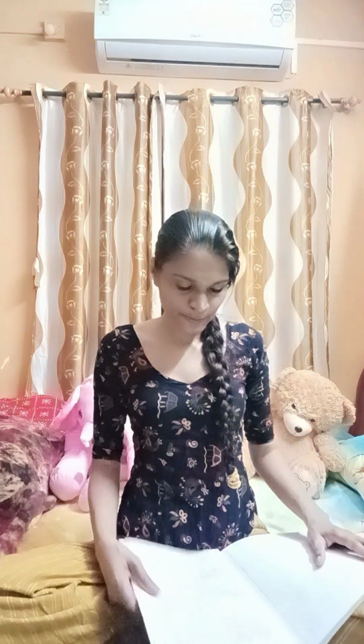And when it is a restrictive field, it is horizontally or vertically compressed. There can be contralateral synergistic overaction seen. In Brown syndrome, it is inferior oblique underaction that is seen, sorry, not overaction. That chart I'm going to show, and it looks like a dog-eared, folded ear like this. So I'm going to share that here.